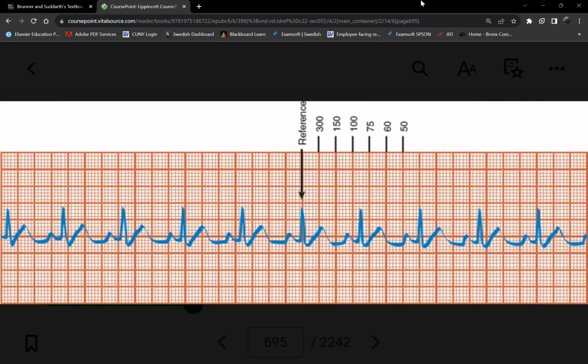What if you have an irregular rhythm? That method will not work. Will any of these methods actually work? None will work because if you think about it, if it's an irregular rhythm, will the heart rate be the same from 1 minute to the next? No. Never. It will never be the same if it's irregular. Make sense? Okay.